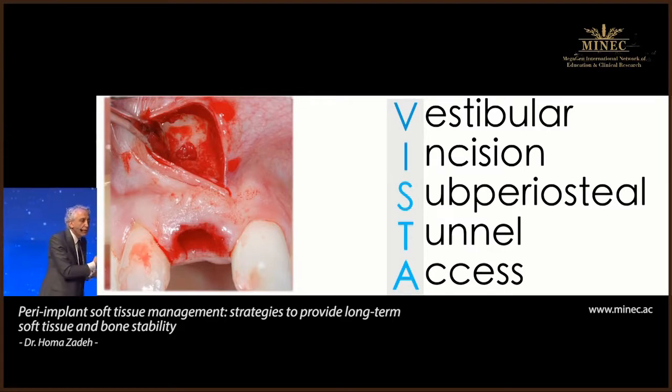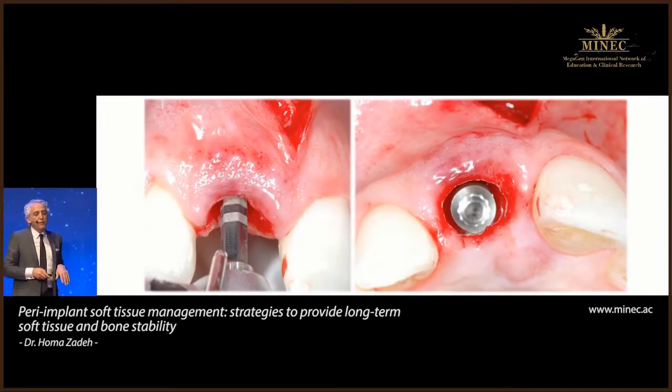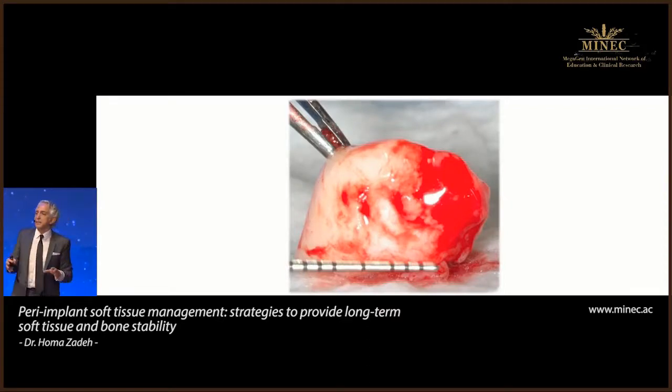That gives us access to the facial plate for soft tissue augmentation, also making sure that that periapical fenestration is repaired.